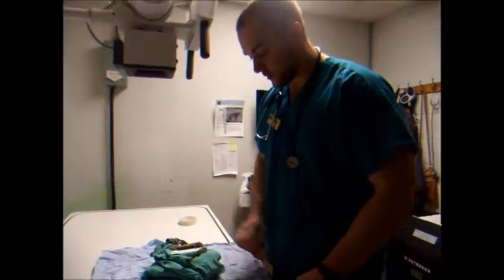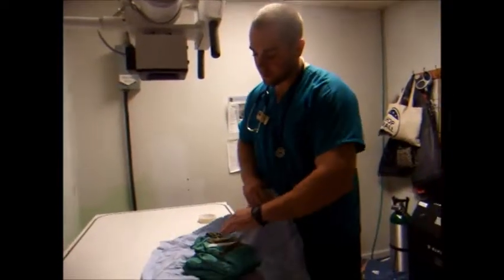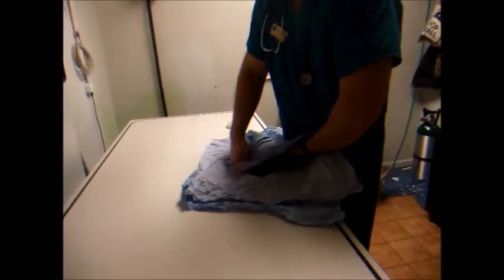Alright, I've got my indicator strip. I'm going to put that right on top, and then we're just going to wrap this up here. Down. We want to wrap it as tightly as possible.